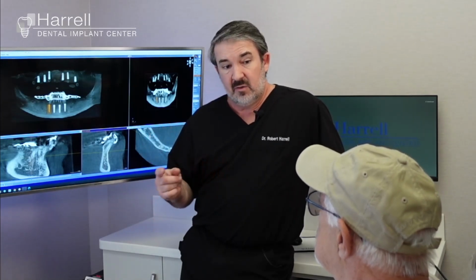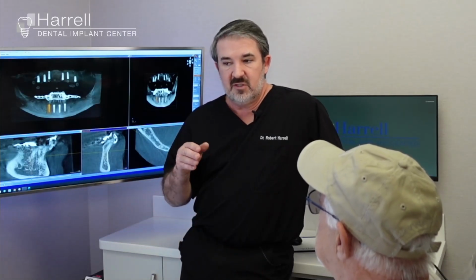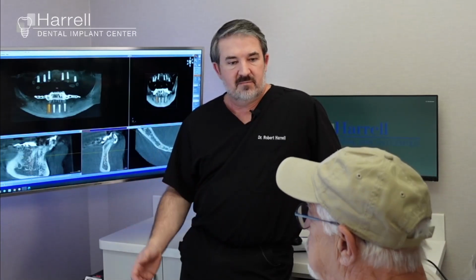You'll come back in about 2 weeks for a check, an adjustment. We're just checking the bite, making sure everything feels good when you eat, not having any issues with anything rubbing. This is with the permanent set? That's with the permanent set. Okay. And it's with the initial set as well. Right. There's going to be check steps all along the way to make sure that you're comfortable, not having anything bothering you or giving you trouble.